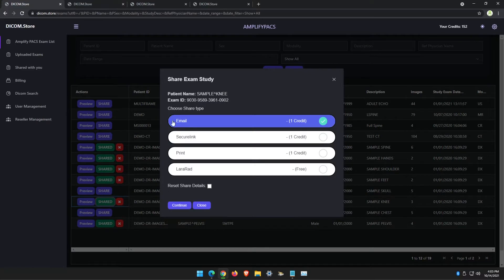It doesn't cost anything extra. Once you've shared it, it'll unlock unlimited sharing, so you can print it as many times as you need to, or send via email.